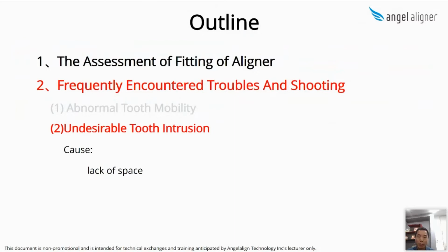If a tooth has a force placed on it but insufficient space to bring it into the arch, it will not move. Similarly, if there is sufficient space but no force engaged on the tooth, it will not move either. So teeth require both force and space to move, and teeth cannot collide into others to reach the position in reality.